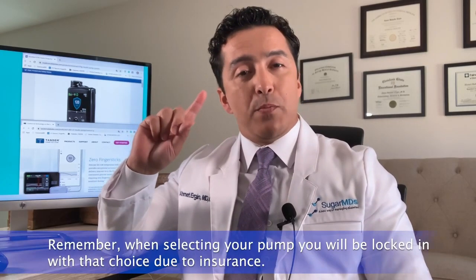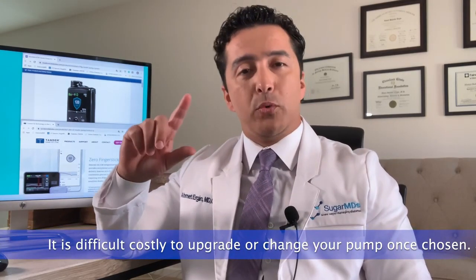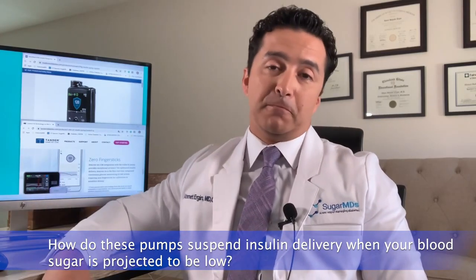Today we are going to summarize the important clinical features of these two pumps so you can make the best decision. Remember, when you get a pump you're practically stuck with it for a long time, so it will be difficult or costly to upgrade or change brands. We'll cover how these pumps operate differently, because while the purpose is the same, they are totally differently engineered. First, we'll talk about how these pumps suspend insulin delivery when your blood sugar is about to go low.